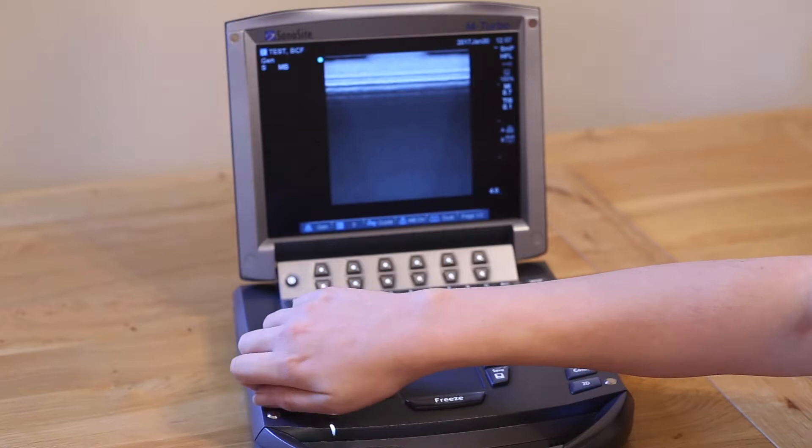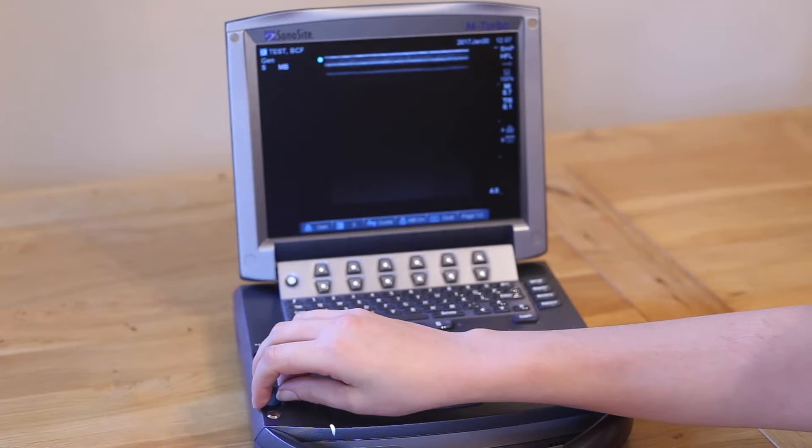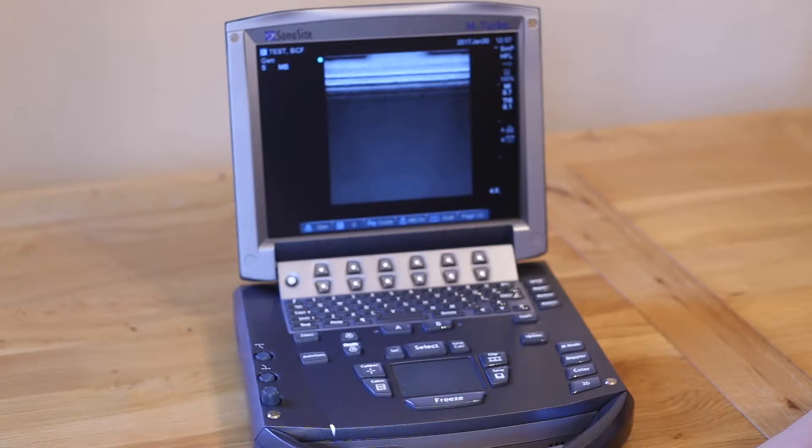Time gain compensation adjusts the gain in either the near field or far field of the image. Pop out these buttons and then turn each one as necessary to ensure you have an even brightness of picture.